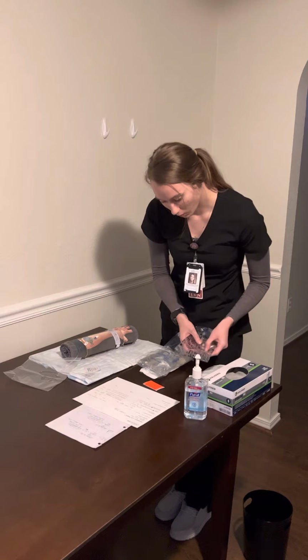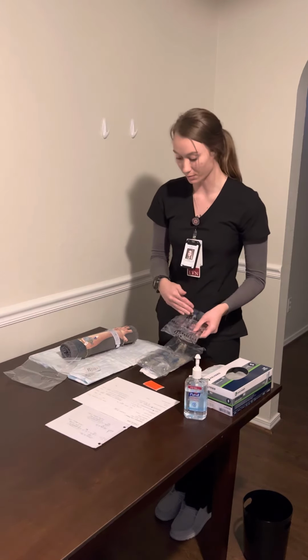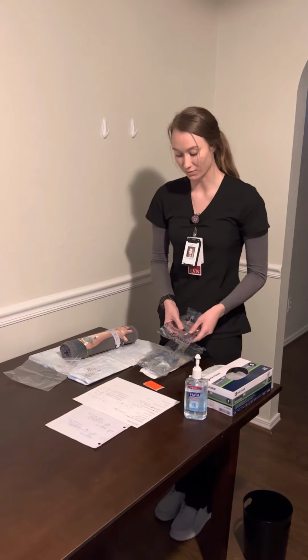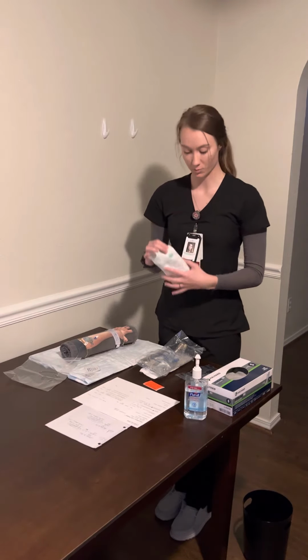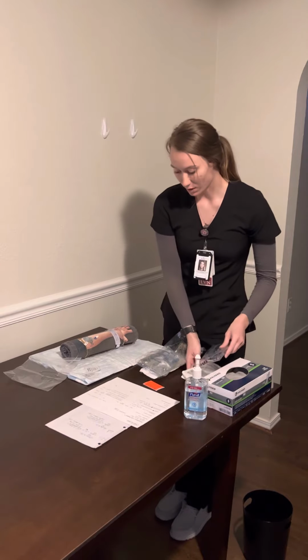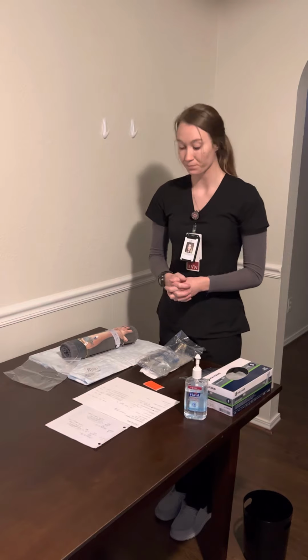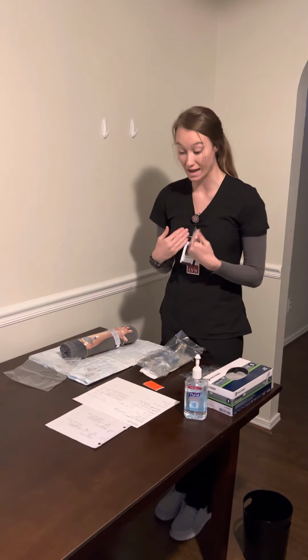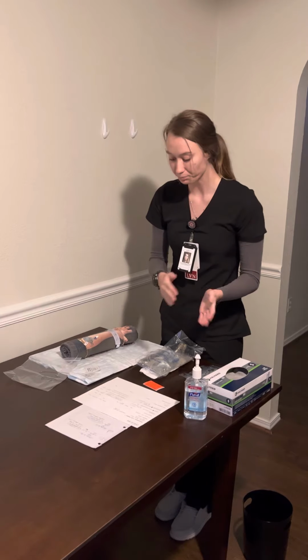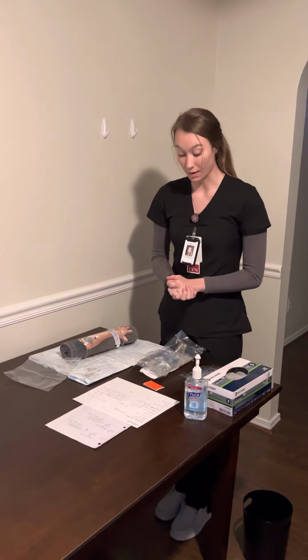The next medication that I have is cefazolin sodium, 1 gram in IV piggyback in 50 milliliters over 30 minutes. With 10 drops per milliliter tubing, the math would be 17 drops a minute, but my secondary tubing is 15 drops per milliliter, so the math will be 25 drops per minute to give that over the correct time frame.